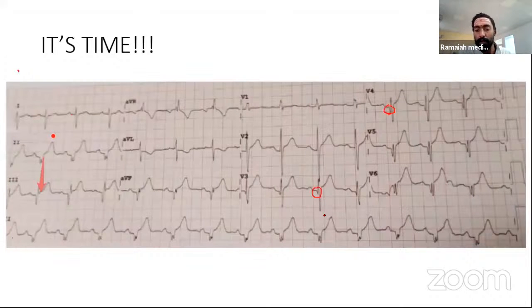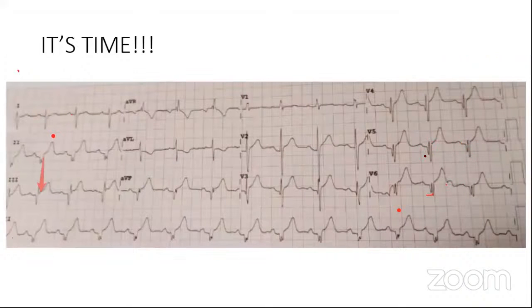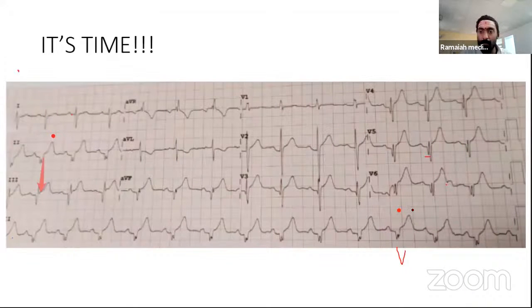In the anterior leads, like V3, V4, you will never get Q. Q represents a scar there. And see here, in V5, V6 you can get a normal Q wave. But here, is it abnormal or normal? Is it pathological or physiological in V5? Pathological, sir. Yeah, the depth is almost equal to the R wave there. Okay, so it is pathological Q waves. Good.